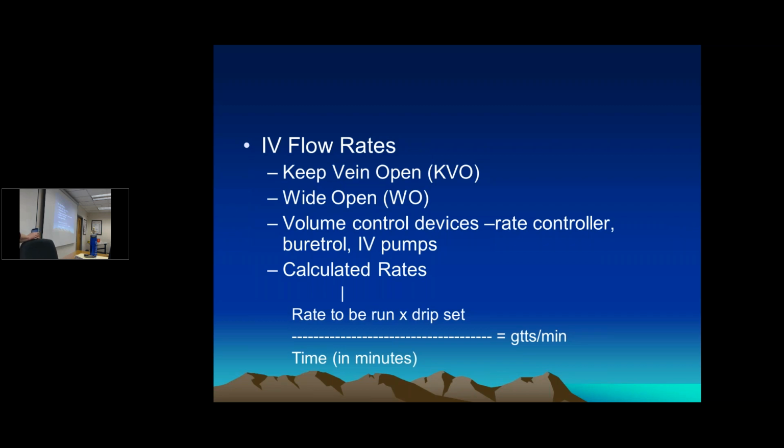Yeah, so right around 21 drops per minute. Like I was telling you earlier, the idea is that it's probably not practical unless you happen to be doing in-facility type transports, that you would get down to this. But nevertheless, this is one of the things for curriculum purposes that you need to know about, okay? I'm going to give you a worksheet this afternoon that's all about this. That will be due next month. Questions about this?